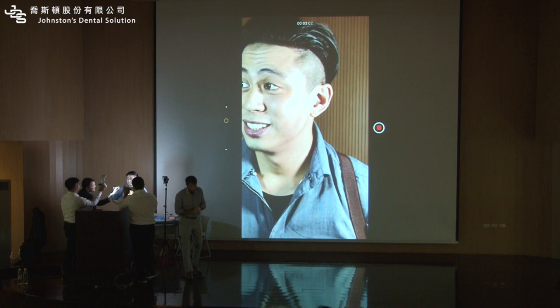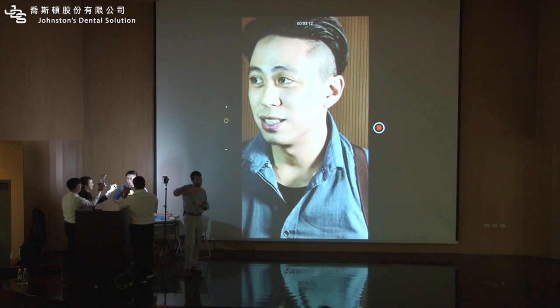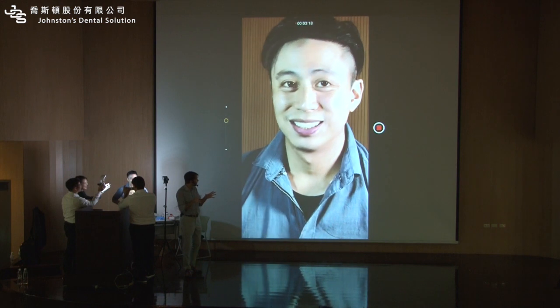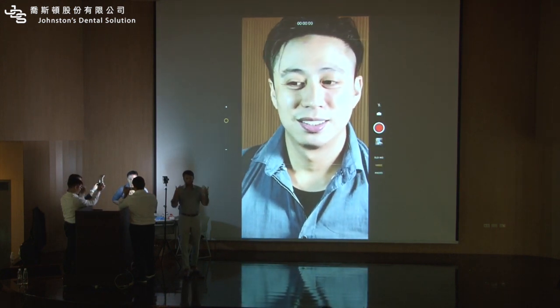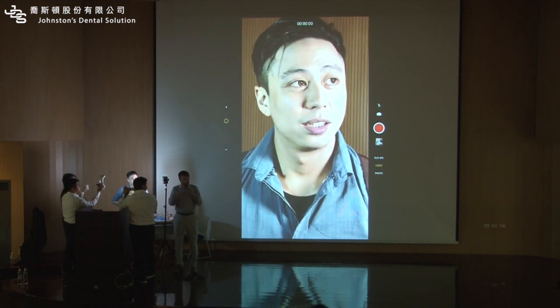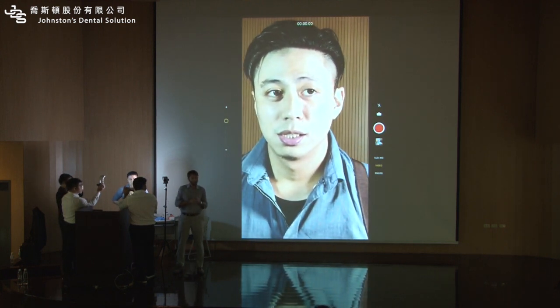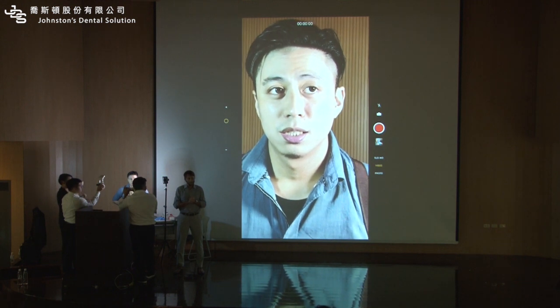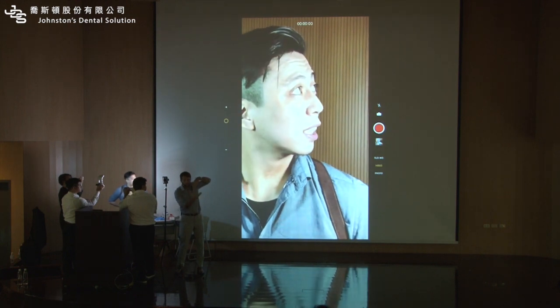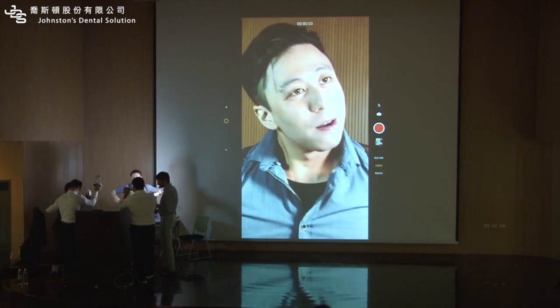When he becomes amazingly surprised, then he relaxes. And then you can make even nicer videos. So I suggest two videos. One to create an initial nice photo, and a second one for him to give you even better. And then afterwards, when you're explaining the treatment, you can even give the mirror so they can see the limitations of the mock-up, because the limitations of the mock-up will also help you explain the treatment plan later. For example, telling him that he needs ortho to bring the teeth back, otherwise it's going to look too bulky, things like this. Okay? So now, Henry, I need you to relax.